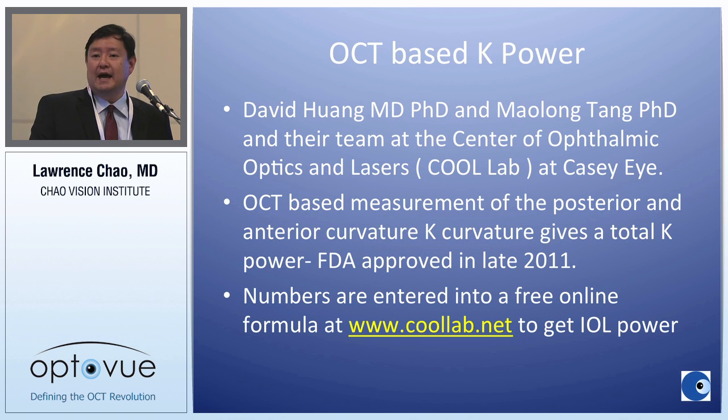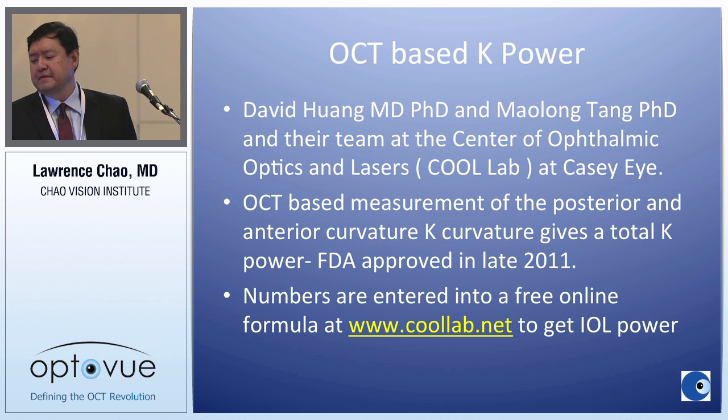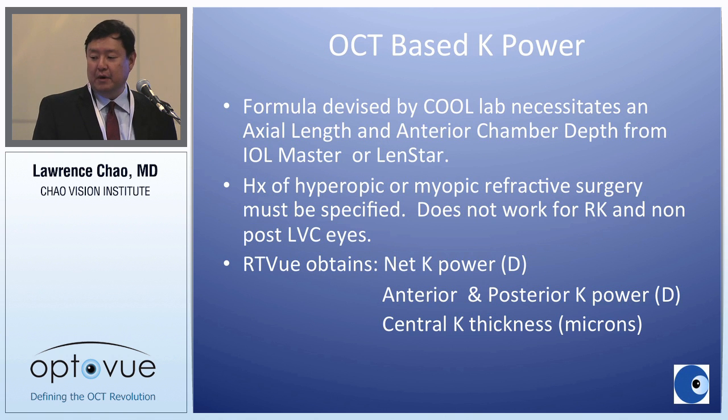He started a lab called the COOL Lab, which stands for the Center for Ophthalmic Optics and Lasers. And they pioneered this work to measure both the anterior and posterior corneal curvatures to give a total corneal power. And I think this was approved somewhere around November of 2011. These numbers are then entered onto a free online formula at coollab.net to obtain an IOL power.